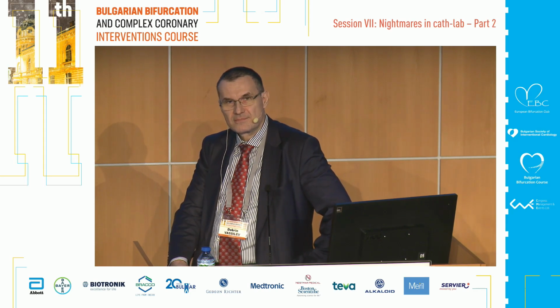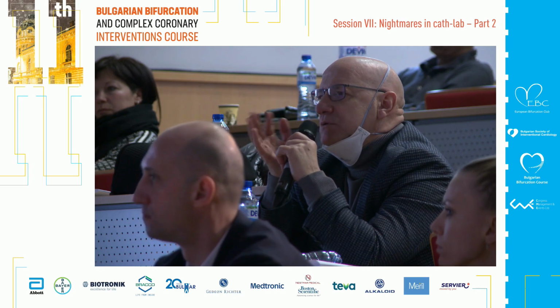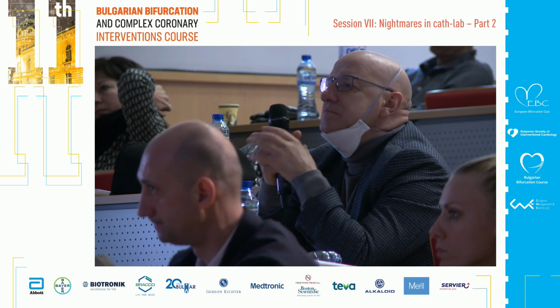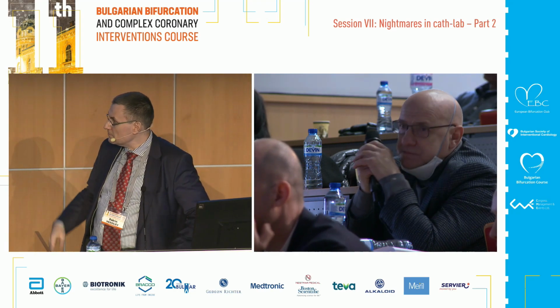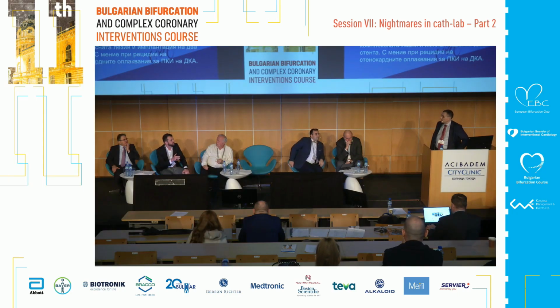One more question. How did you manage the distal lesion, which was even more severe? I mean, with the balloon, a lot of balloons. But this is subintimally there. First subintimally, up to the apex. But why? My technical question is, why did you go so far away with the XTR wire, subintimal? Why don't you stop at the distal stenosis, dilate the proximal, and after that work?